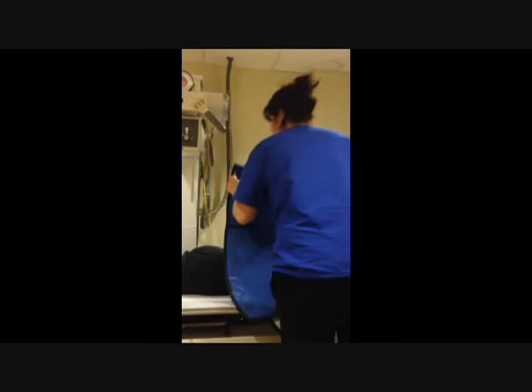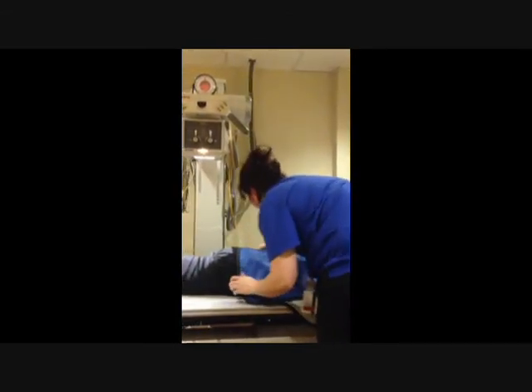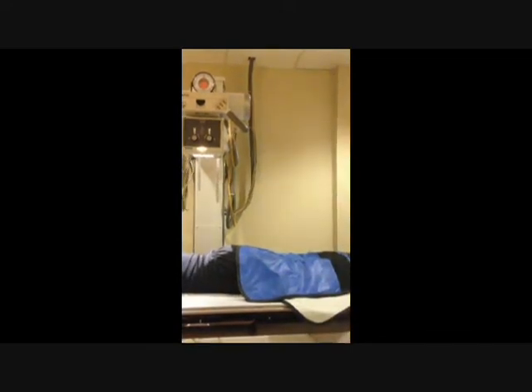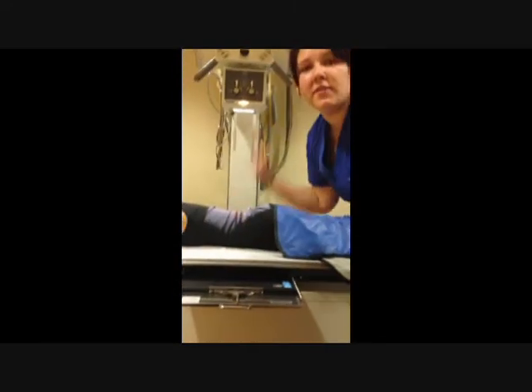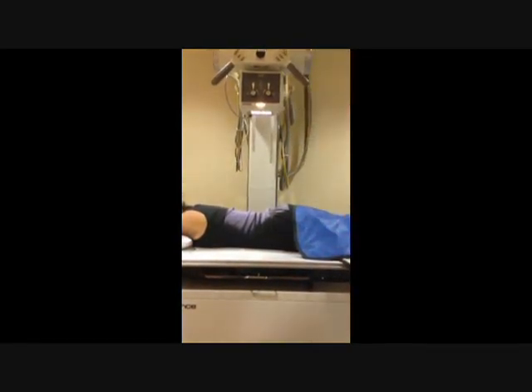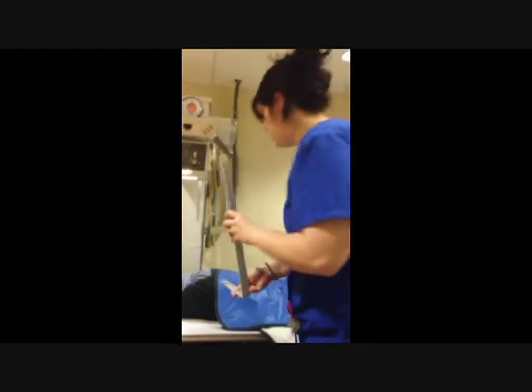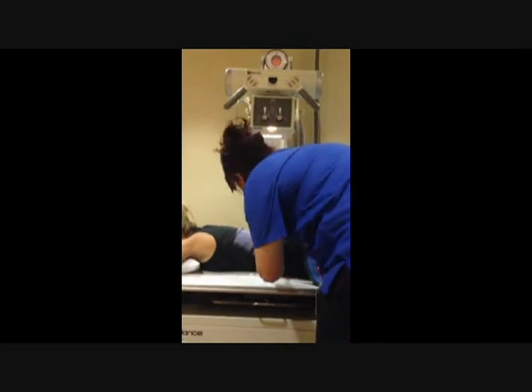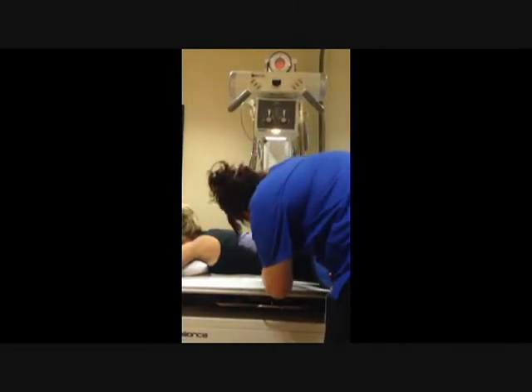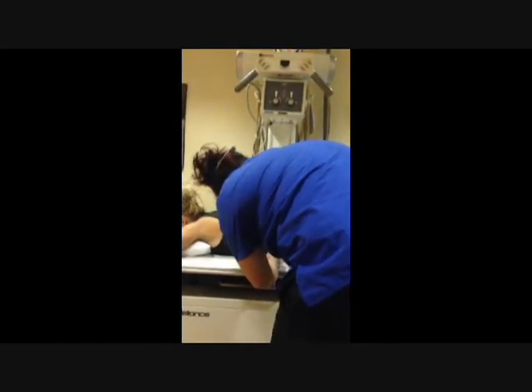Then we're going to take our shield and put it again over her femurs to help protect her. Get her up as close as we can to the light. Again, you just want to make sure that all your stuff is lined up. And again, to get your exposure factors, you're going to take your calipers and measure. Shouldn't be much of a difference. I'm going to say 19.